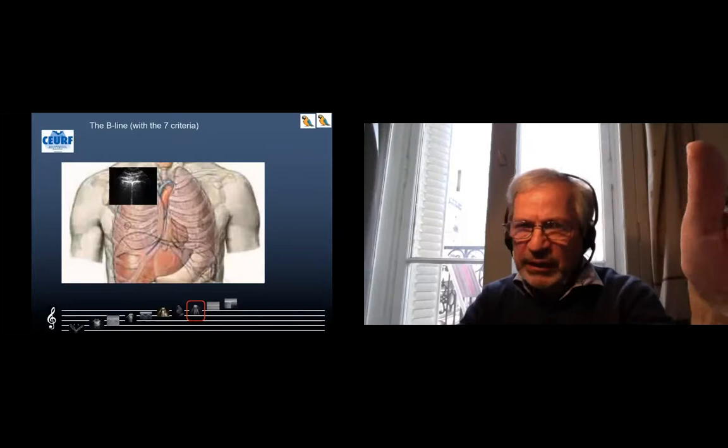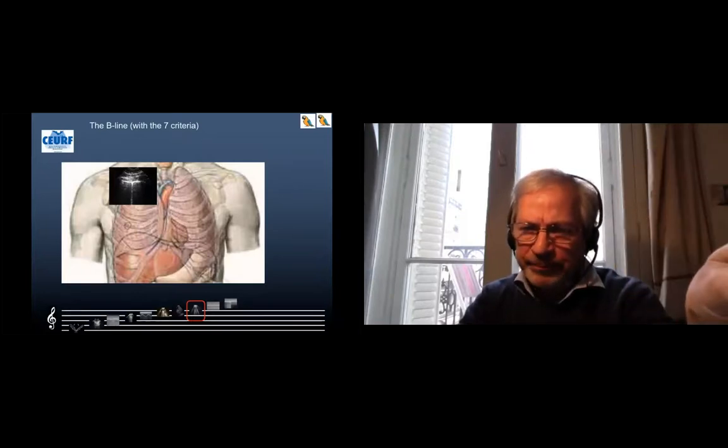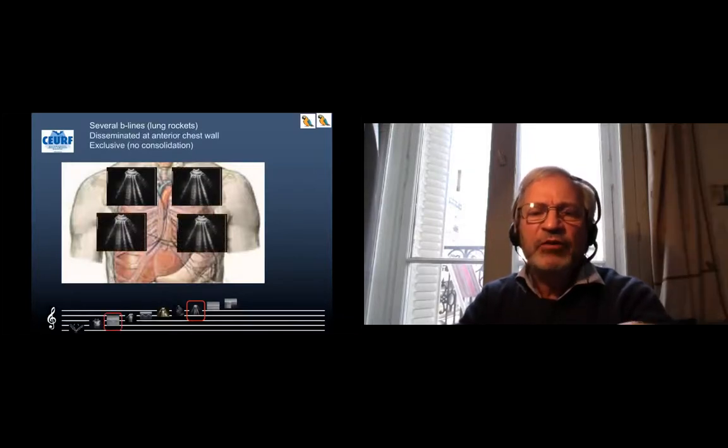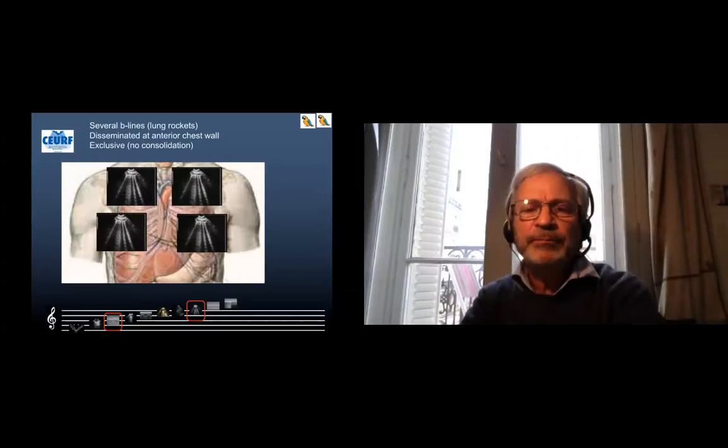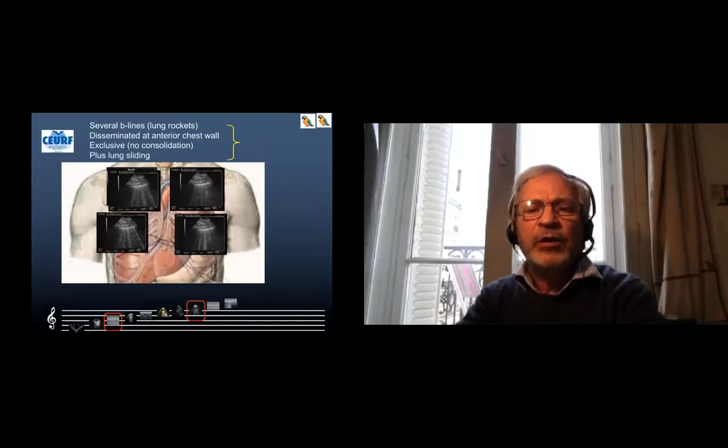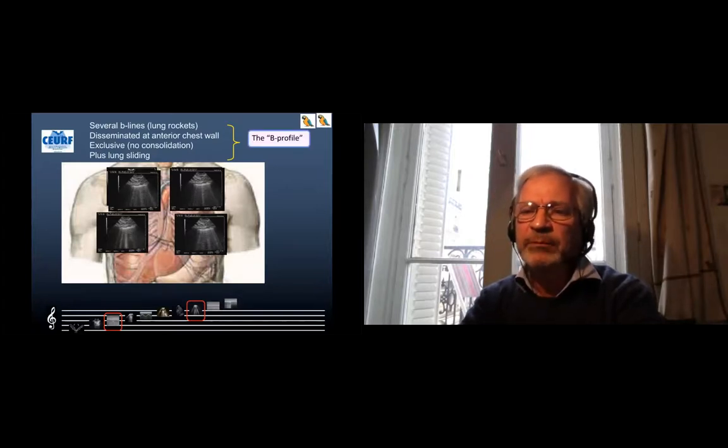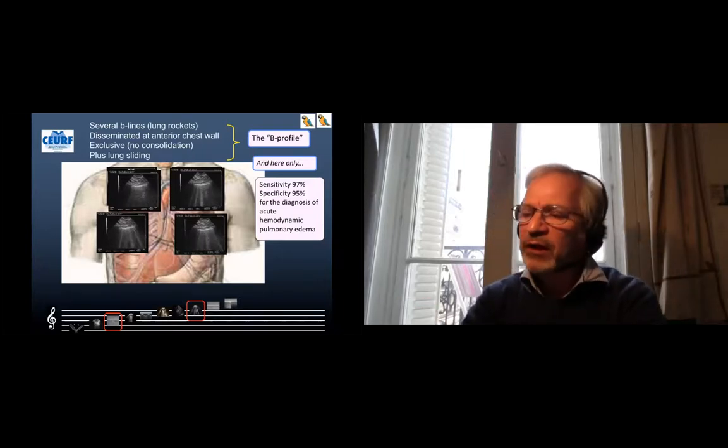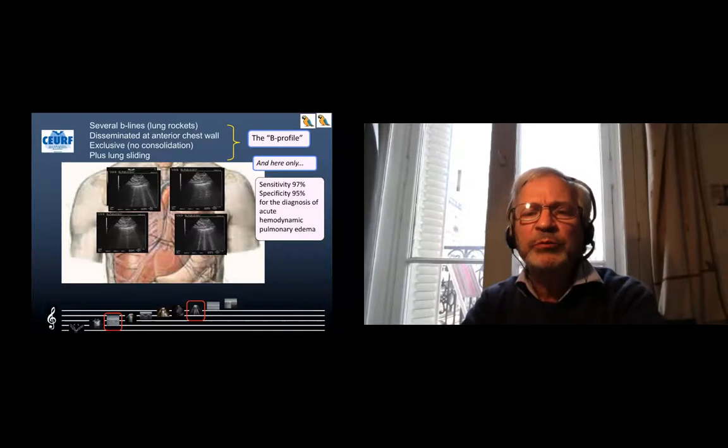Time is running very fast. We have to remind again the B profile, which is maybe for the beginners the most important part of the BLUE protocol. So we say it differently: this is a B-line with the seven criteria. These are lung rockets, several B-lines. These several B-lines are disseminated harmoniously to the whole anterior wall. I do not see any consolidation and the lung sliding is present. This is the B profile. And now and only now we can say sensitivity 97%, specificity 95% for acute hemodynamic pulmonary edema.